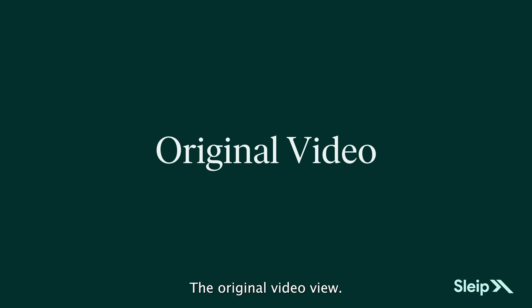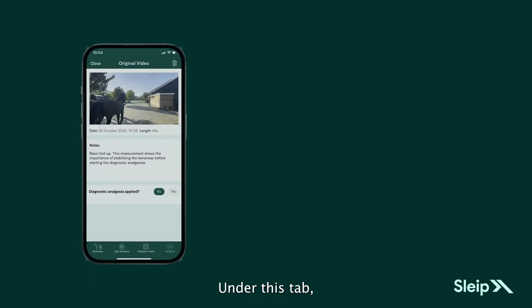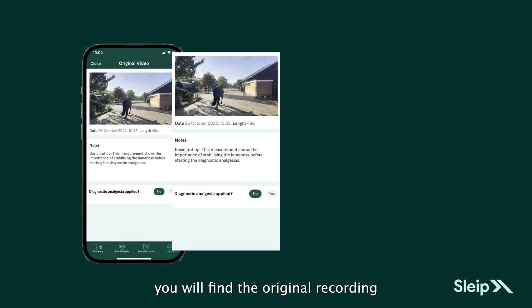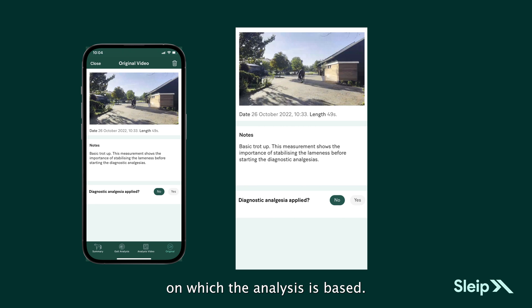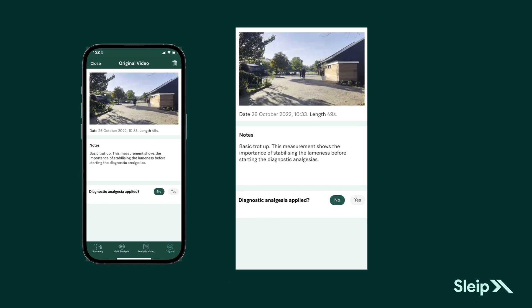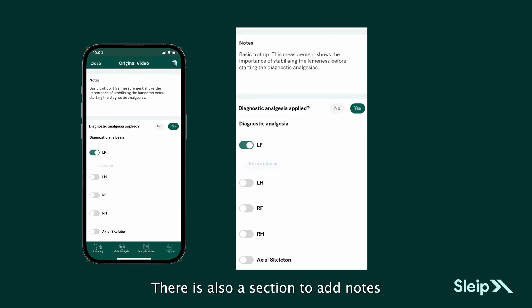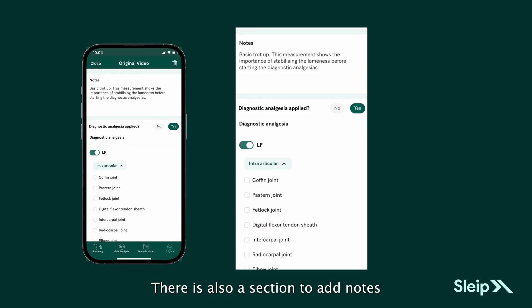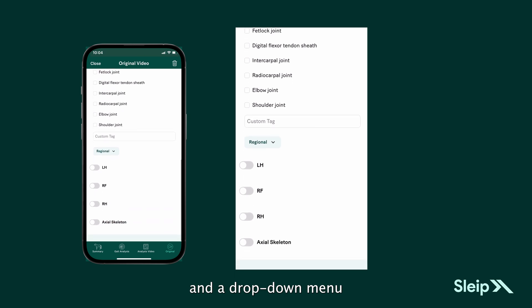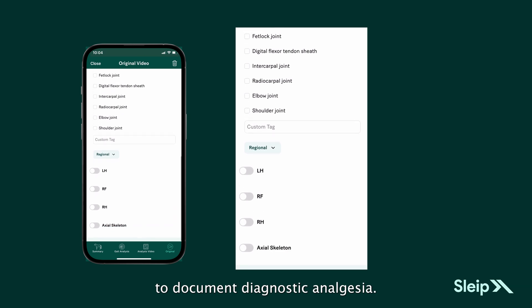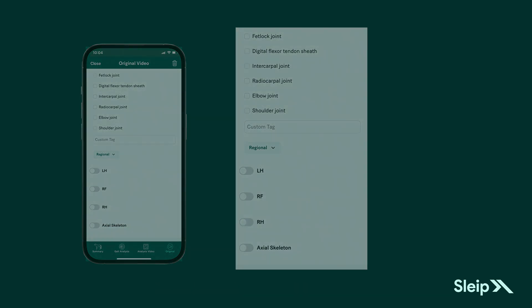Under the Original Video View tab, you will find the original recording on which the analysis is based. There is also a section to add notes and a drop-down menu to document diagnostic analgesia.